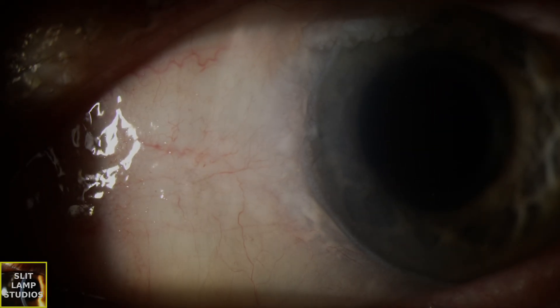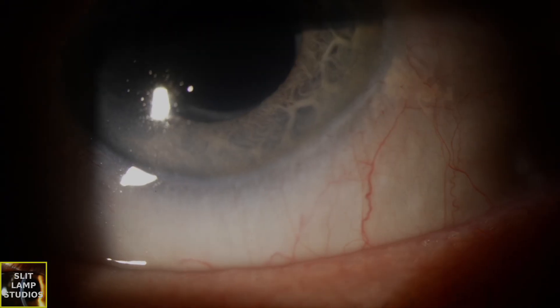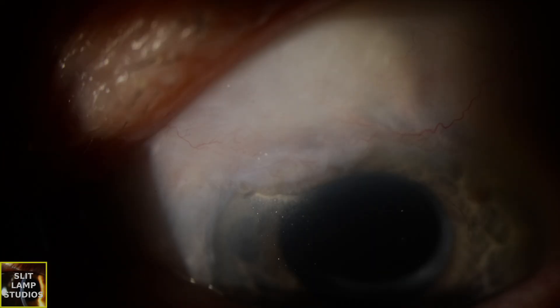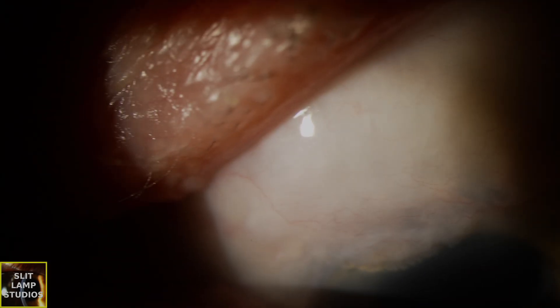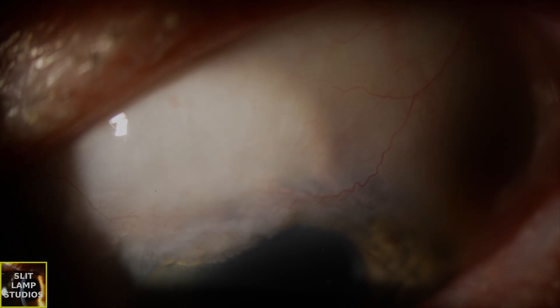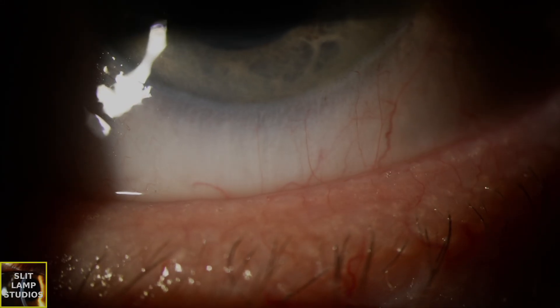In this case, there was no leak, but the patient had a good bleb and was also on multiple topical IOP-lowering treatments. So we stopped one of these and arranged follow-up in our glaucoma clinic. There you can see that trabeculectomy bleb, and we're going to see how they go.